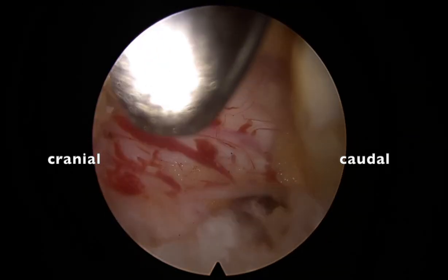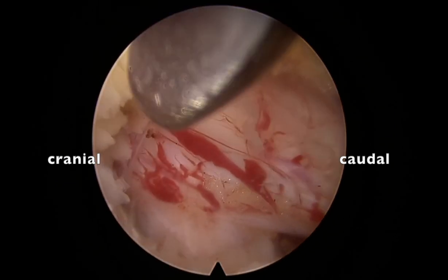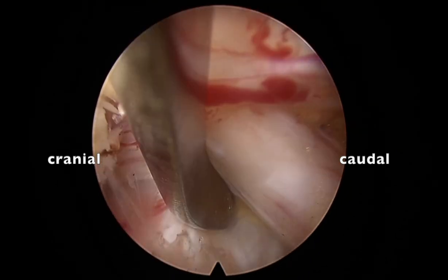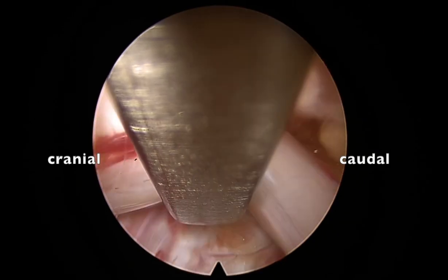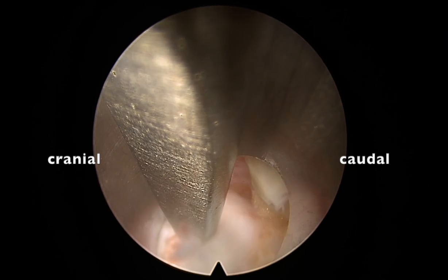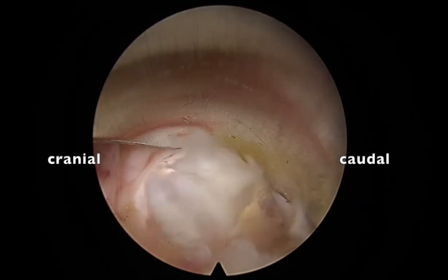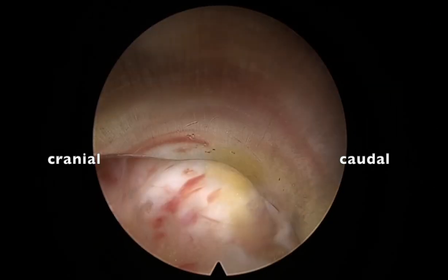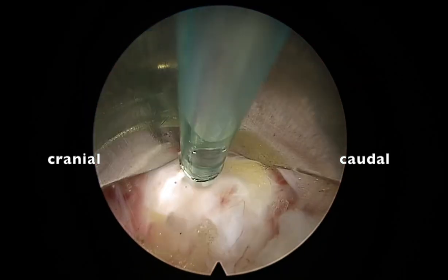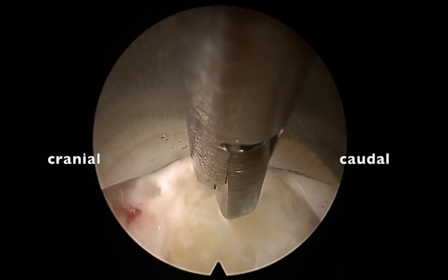This is important — otherwise we will injure the traversing root. If you keep there and rotate the cannula or the sheath, it will injure the axilla. Always be careful and identify the anatomy. Now I am pushing and mobilizing the traversing root medially, then push the sleeve down and rotate it. The sleeve is now protecting the traversing root. This is the beauty of full endoscopy — no need for additional retractors, very neat, smooth, and accurate.